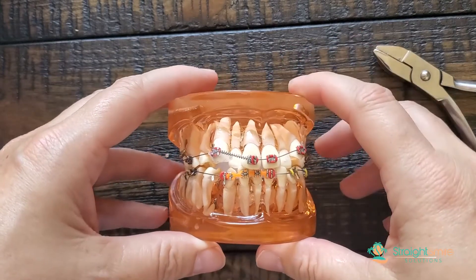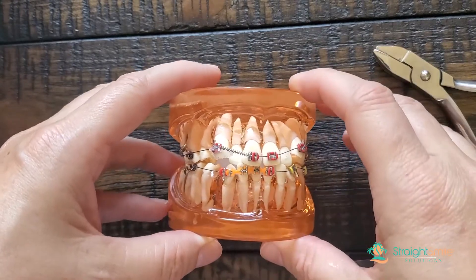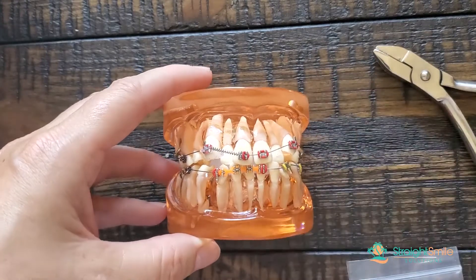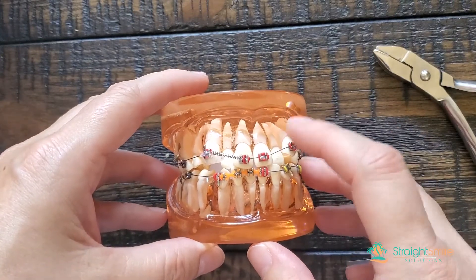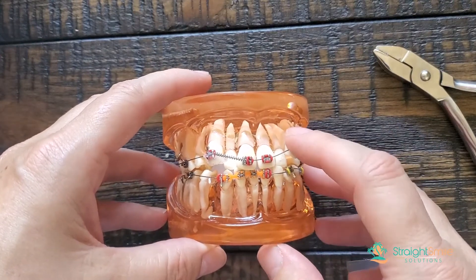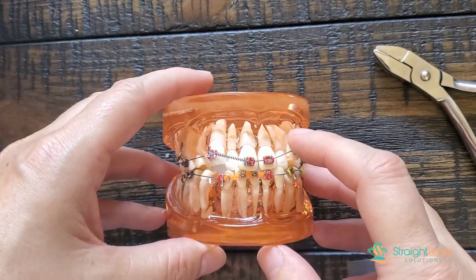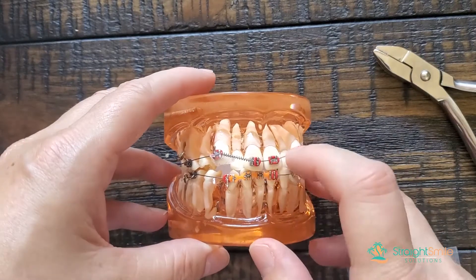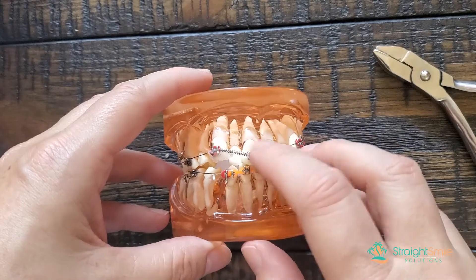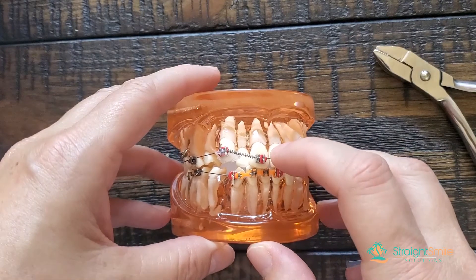Another way you could do it would be to just totally untie it and put a bigger piece of open coil spring in. Keep in mind, I'm not going to use open coil springs on a light NiTi wire like this. The lightest wire I'm going to use an open coil spring on is maybe a 1725 NiTi. I prefer 1825 NiTi — the more I can fill the slot, the better. So this is just an example here, just so you can understand the point of the crimpable stop.